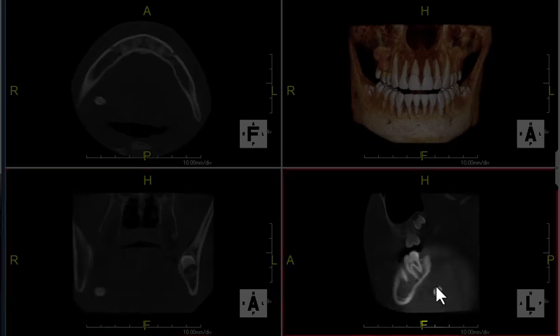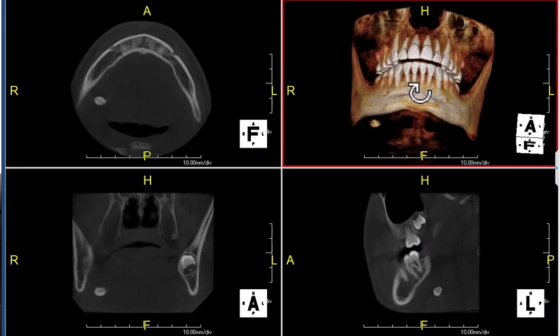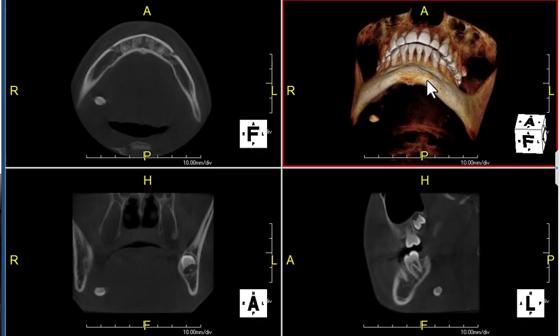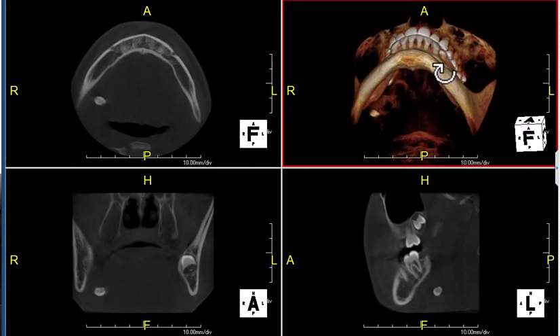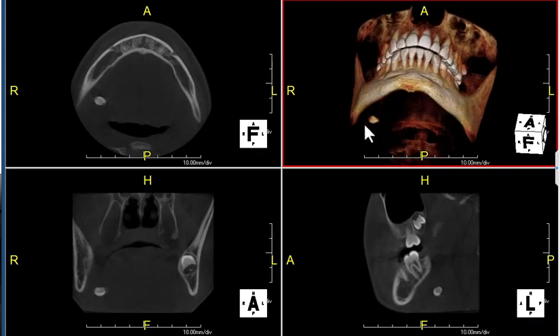You can see on this view, right-hand side, it's out there in the gland itself. A little different view here — and there it is on the three-dimensional image, which is pretty cool. It looks like it's floating in space there. So: a sialolith in the body of the right submandibular gland.